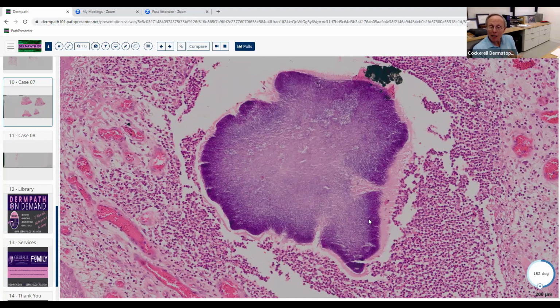What are a couple of others? We know we've got gram-positive coccal bacteria. Now we've got fungi with a eumycotic grain in the skin. Those are often dematiaceous organisms, like Pseudallescheria boydii or Madurella mycetomatis, Madura foot, those kinds of grains.